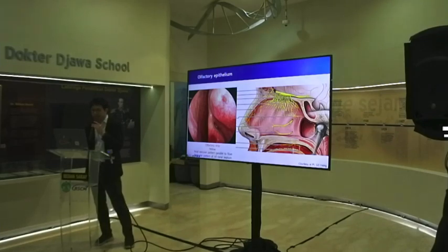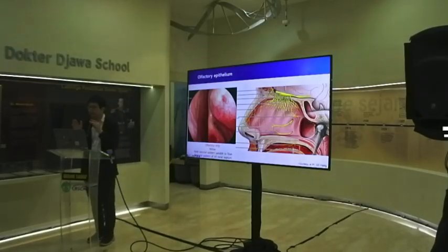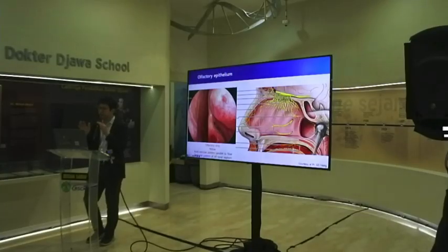This endoscopic view shows the olfactory strip and olfactory epithelium, which is a key area to be aware of. We can identify the olfactory strip, and you can see the fine yellow axial vascular pattern like this, running parallel to the fibers. So always preserve the olfactory strip to secure olfaction.